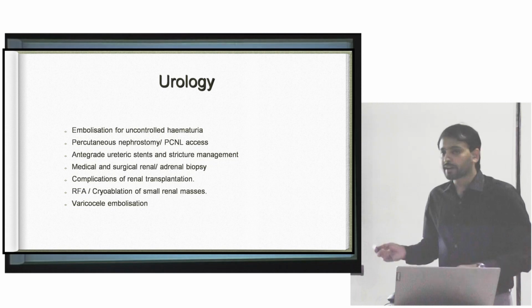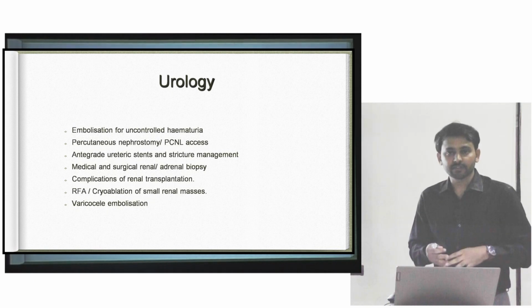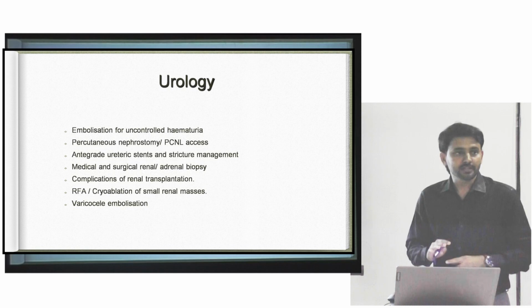And another one is varicocele embolization, and for RCC, radiofrequency ablation for a single solitary lesion less than 3 centimeters. RFA is a very effective and beautiful procedure which can give results almost similar to surgery.